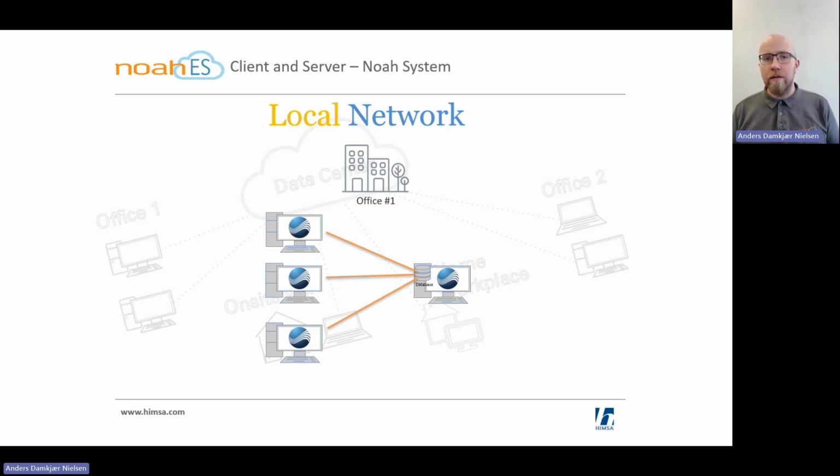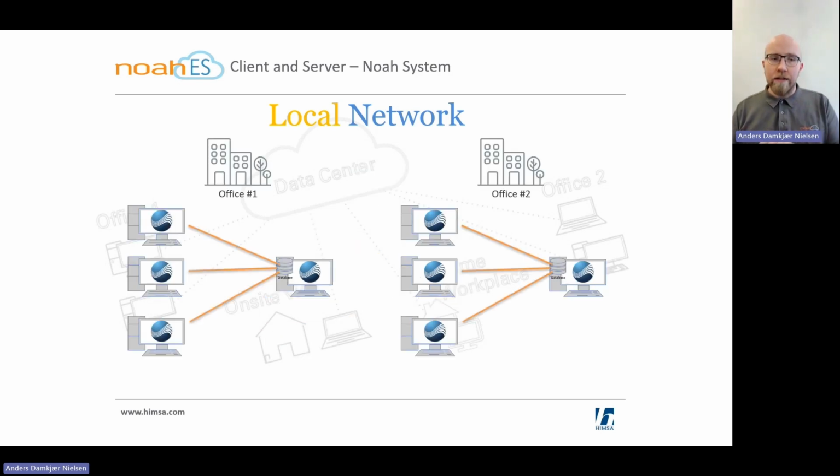But then we get into the hurdle that this works when you have one office. When you all of a sudden have a second office, a second clinic somewhere, now you have a problem because the local network can no longer support this. Because it's a local network, your offices won't be combined and you risk having multiple offices with different patient databases, which means you can't offer the patient that they can go to any of the two shops. They have to go to the same shop, or you have to know in advance so you can send the file over. And exchanging these NHAX files is just generally not very easy.